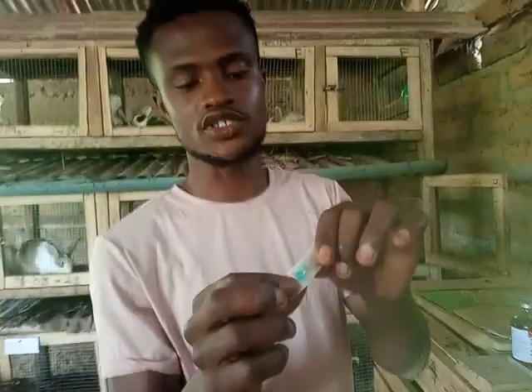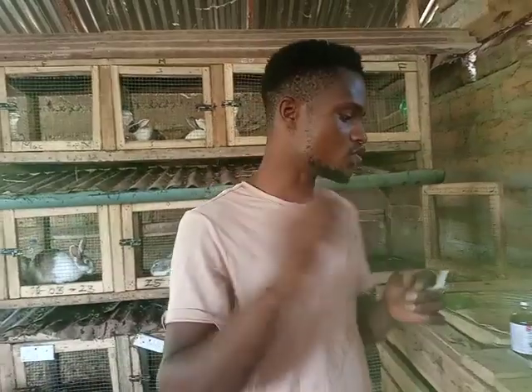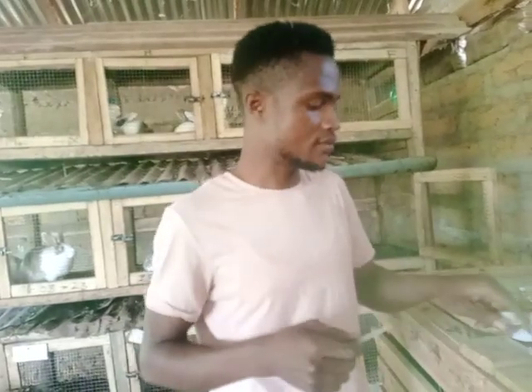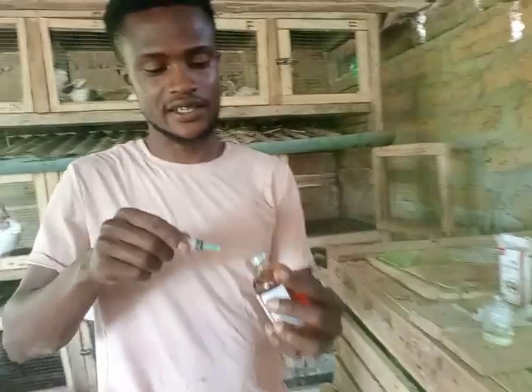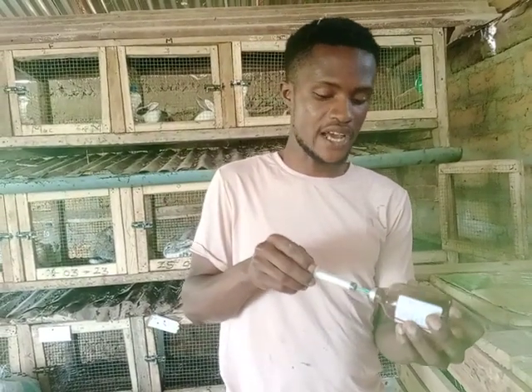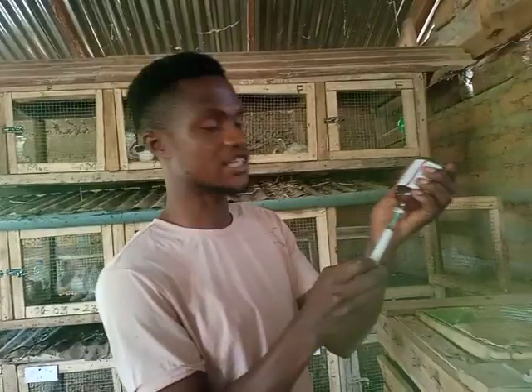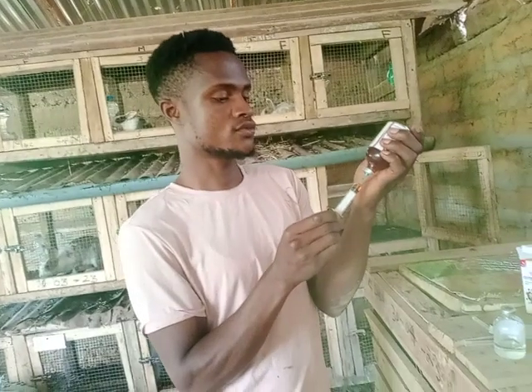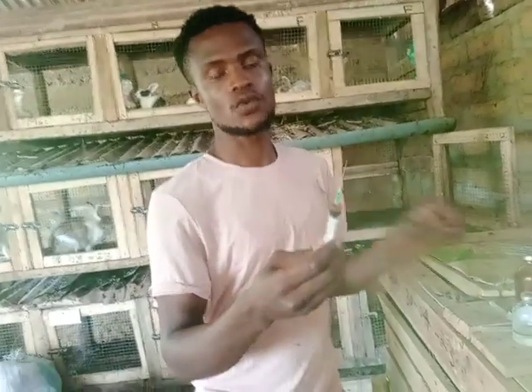This brand new needle, as you can see, I'm just doing some unlocking. This brand new needle will be used to insert inside one of the injections, which is the Oxytetracycline. From there, you draw gently until it reaches one mil.